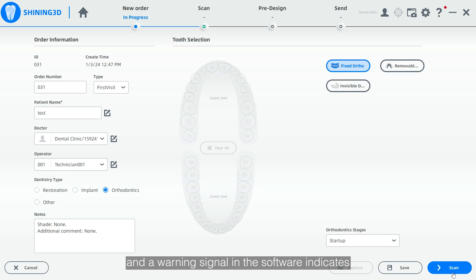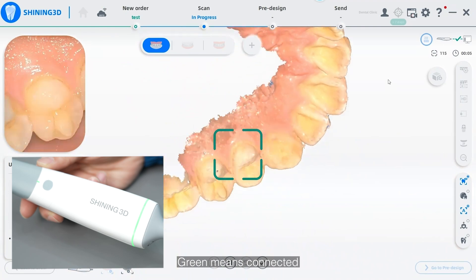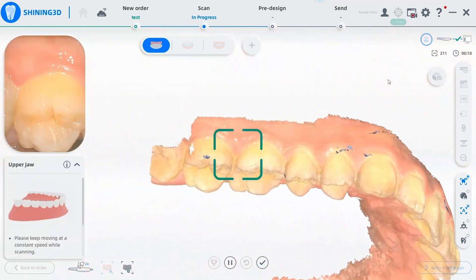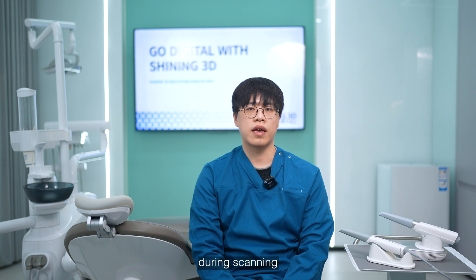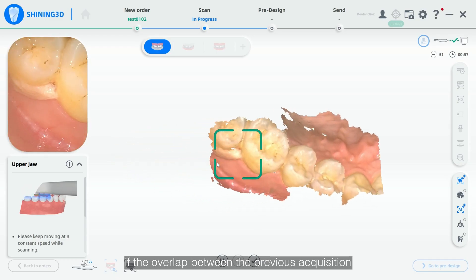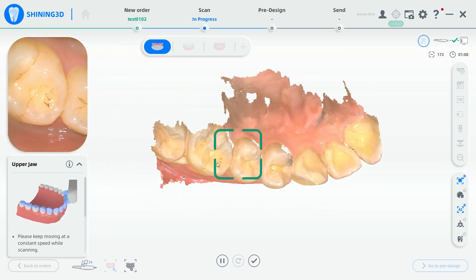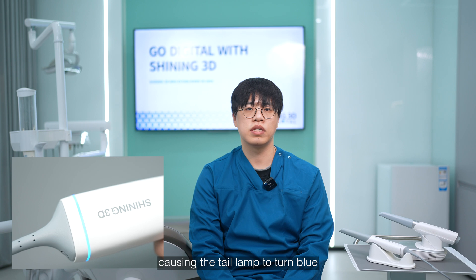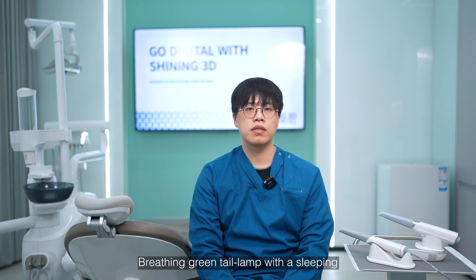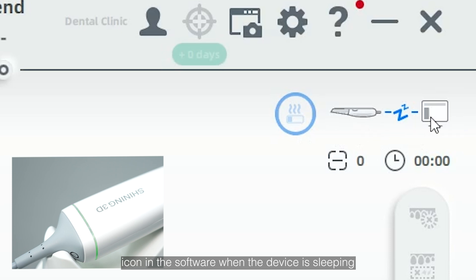Red tile lamp and a warning signal in the software indicates a connection issue. Green means connected, heating, or standby. Blue indicates a data alignment failure during scanning — if the overlap between the previous acquisition and current acquisition is less than 30%, a data alignment failure may happen, causing the tile lamp to turn blue. Blinking green tile lamp with a sleeping icon in the software appears when the device is sleeping.